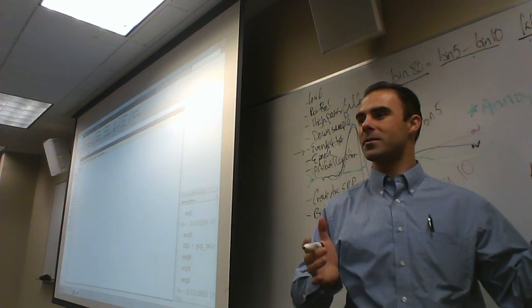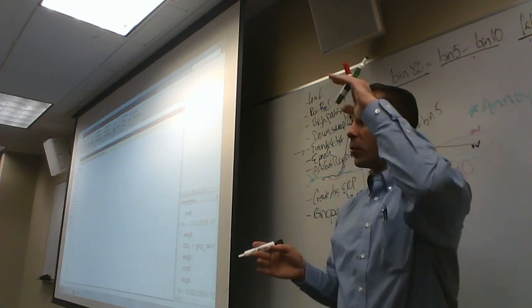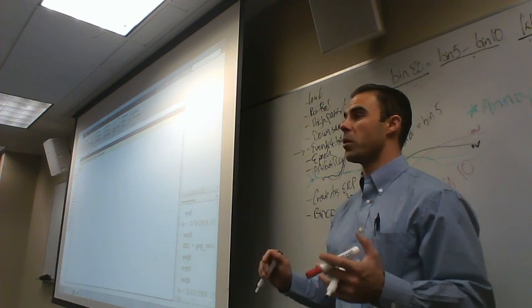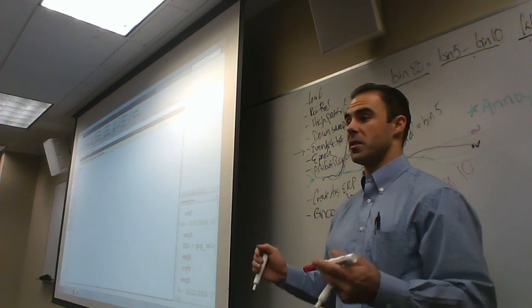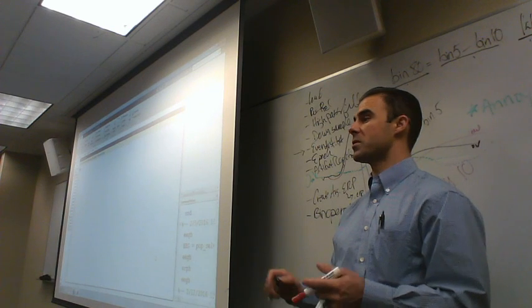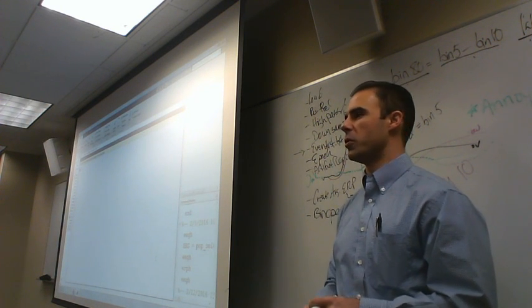Make an events list first. And then you make it, and it's like, all right, sweet, thank you. We'll do bin operations now. So it's important to know these structural aspects of where we're going in our sequences, because you're going to be expected to be able to do this independently on your own. This will be part of the midterm and things like that. You're just going to be given data, and it's going to say, run with it. Tell me what's the answer to this condition at this time at this place. What's the statistical answer? We'll get you ready, but you should be able to know this procedure, and it'll come real easy. It just comes with practice.